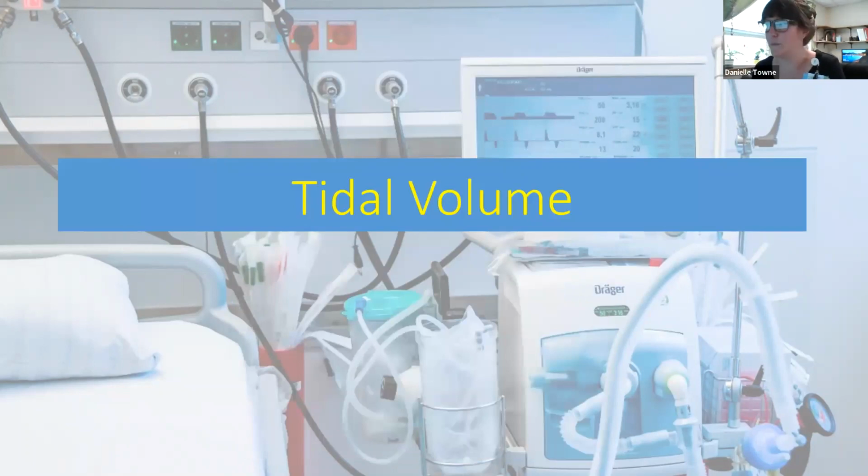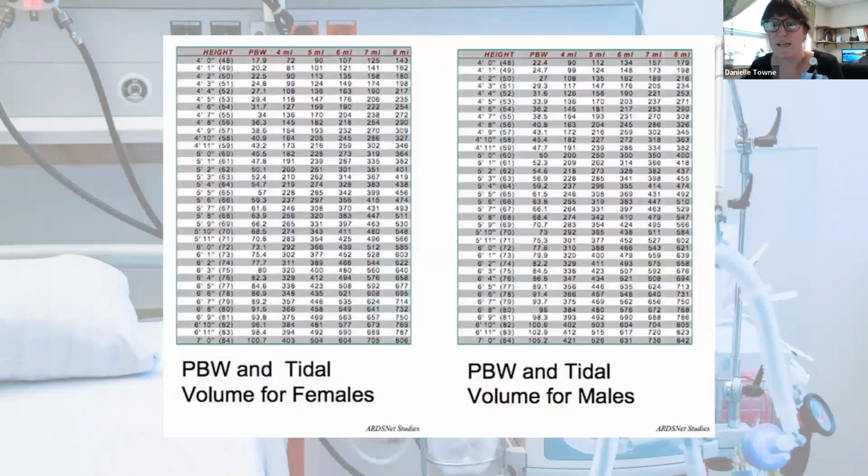Okay, what about our tidal volume? We need to set that. So the tidal volume is the amount of volume delivered with each breath, measured and calculated in mLs. If we're using a volume targeted setting, then we will set the tidal volume directly on the ventilator. If we choose a pressure targeted setting, then we're going to use this number as a goal when we're setting our pressure. So we would set our pressure hoping to achieve a tidal volume close to this.